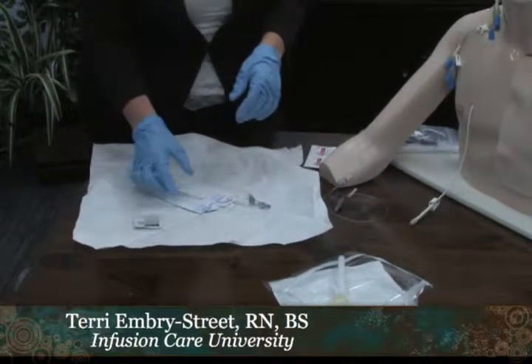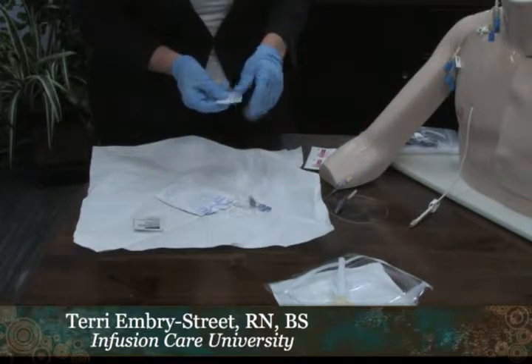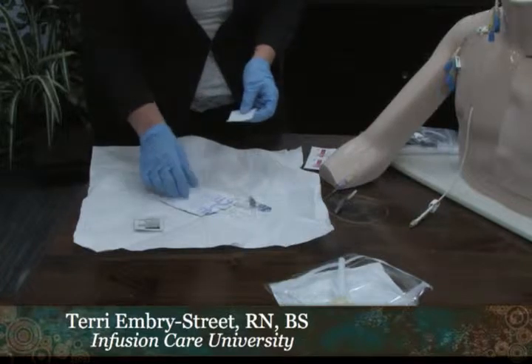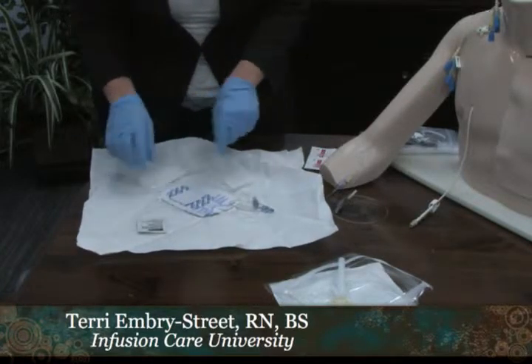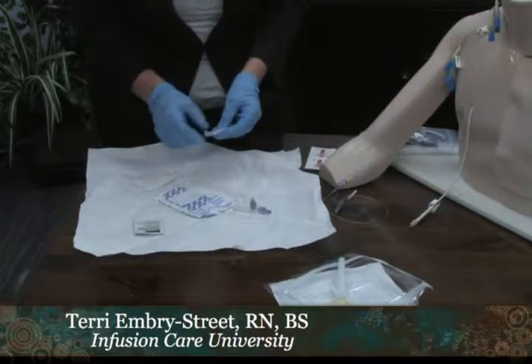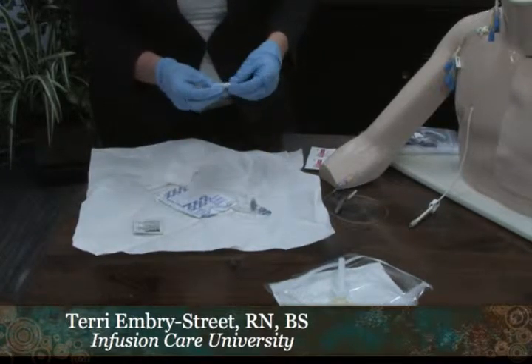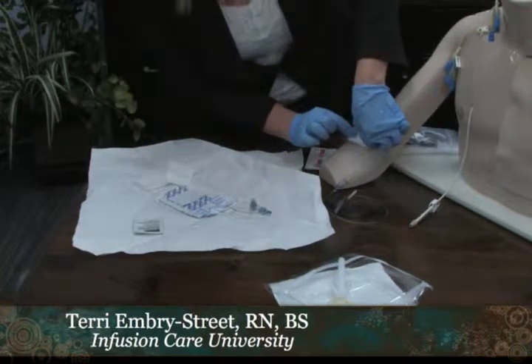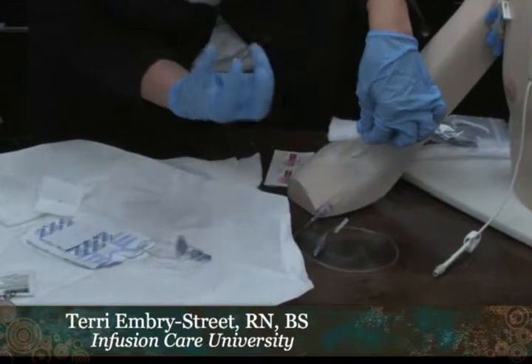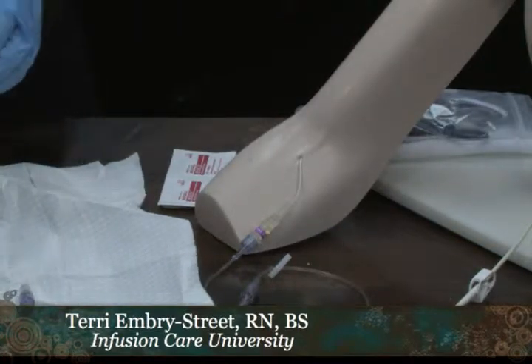It's important to remember that if you put gauze underneath the dressing on either of these catheters, it is then considered a gauze and tape dressing, which must be changed every 48 hours according to INS. Unless you absolutely need it, do not use the gauze. If you have a patient with a PICC line that has some drainage and you want to wick it away, fold your gauze in half and place it a little bit above the site so it literally wicks the drainage away. You don't want to put it directly on the site — placing it above will draw the drainage from the site.